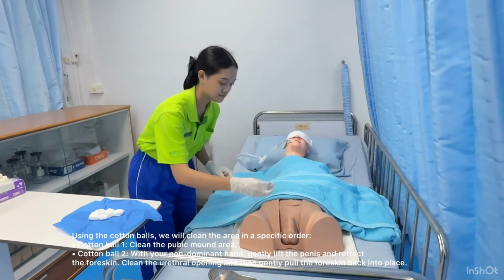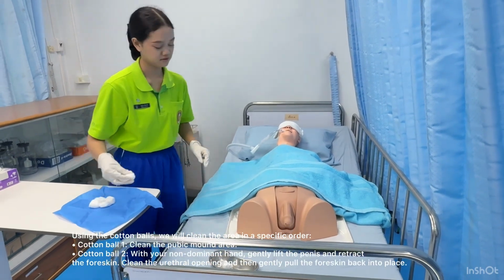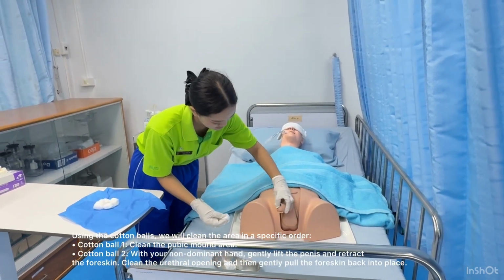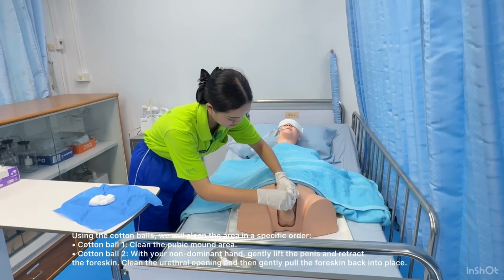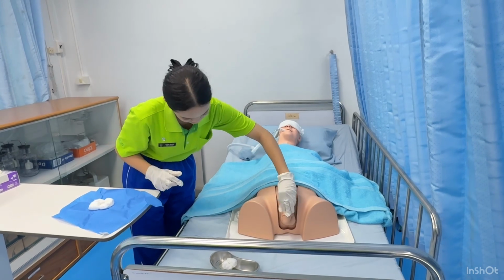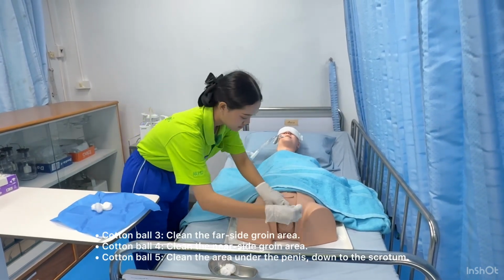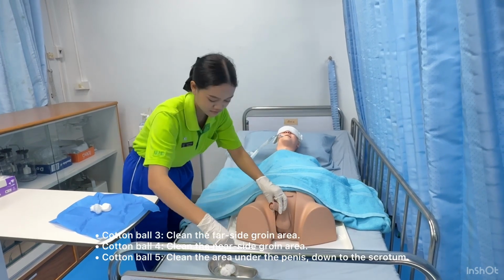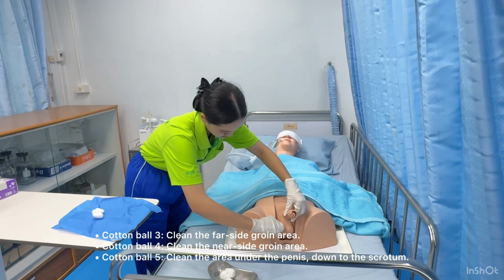Cotton ball 1. Clean the pubic mound area. Cotton ball 2. With your non-dominant hand, gently lift the penis and retract the foreskin. Clean the urethral opening and then gently pull the foreskin back into place. Cotton ball 3. Clean the far side groin area. Cotton ball 4. Clean the near side groin area. Cotton ball 5. Clean the area under the penis, down to the scrotum.